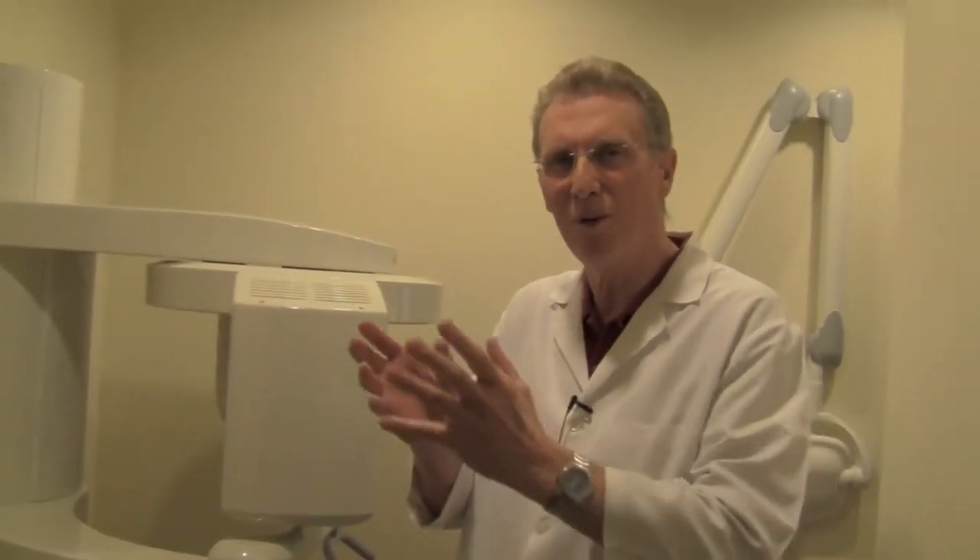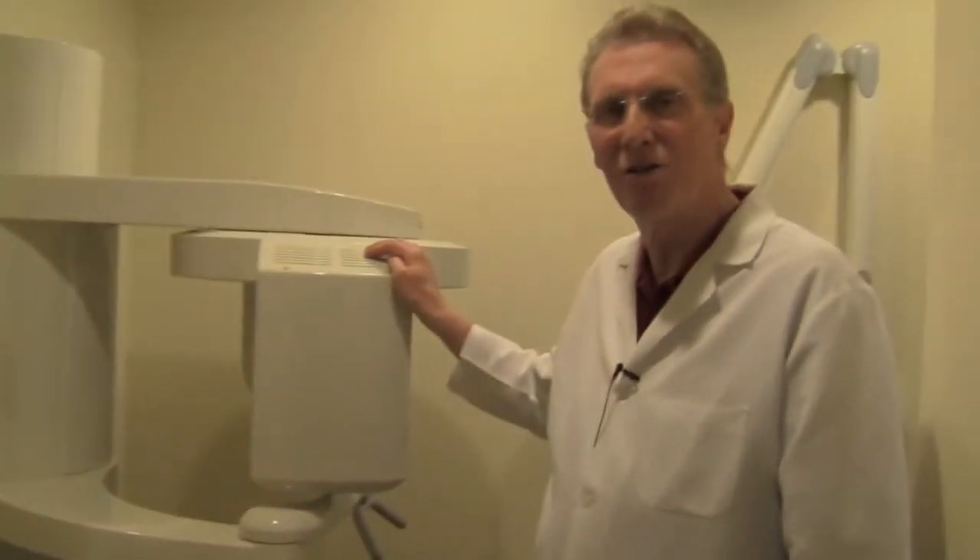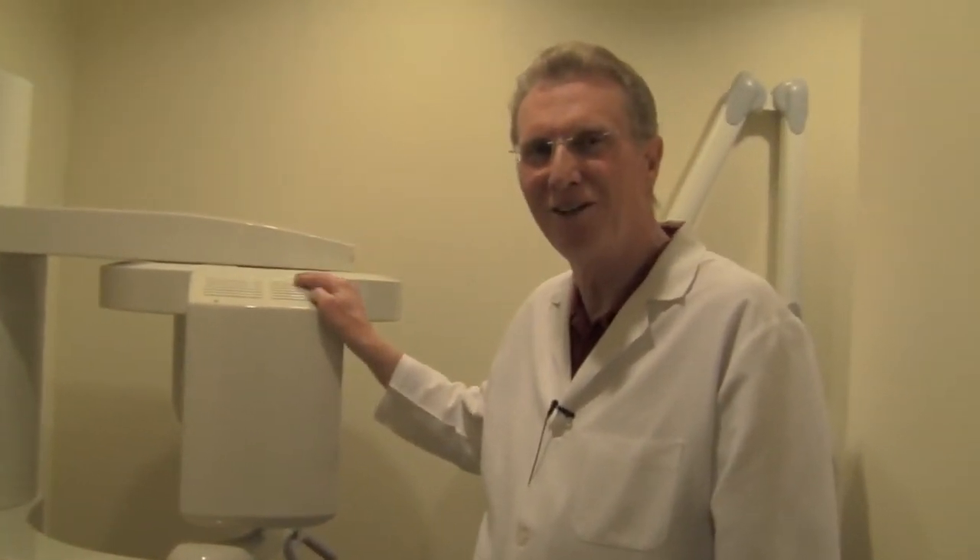The implant is perfectly placed because when I placed it digitally in the x-ray, I was able to get every angle and choose the right size implant for the area and the right length. We can basically place an implant perfectly sized and perfectly placed — and that's the reason we have a tomographic machine. It's state-of-the-art and it's the right way to do things at Layton Dental.